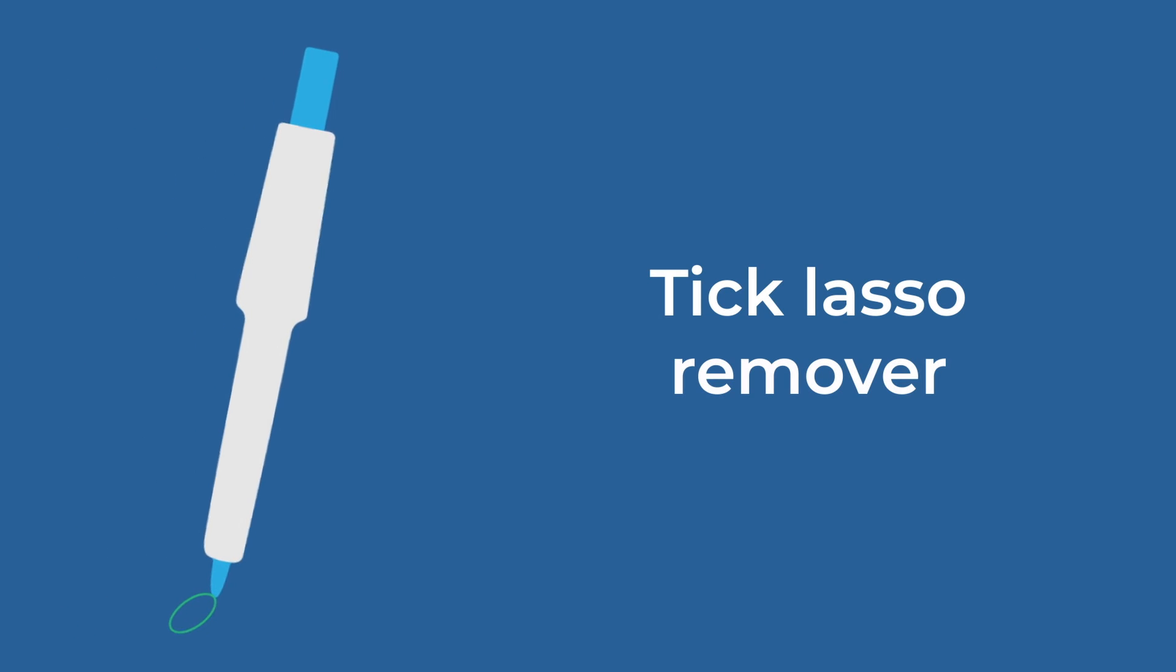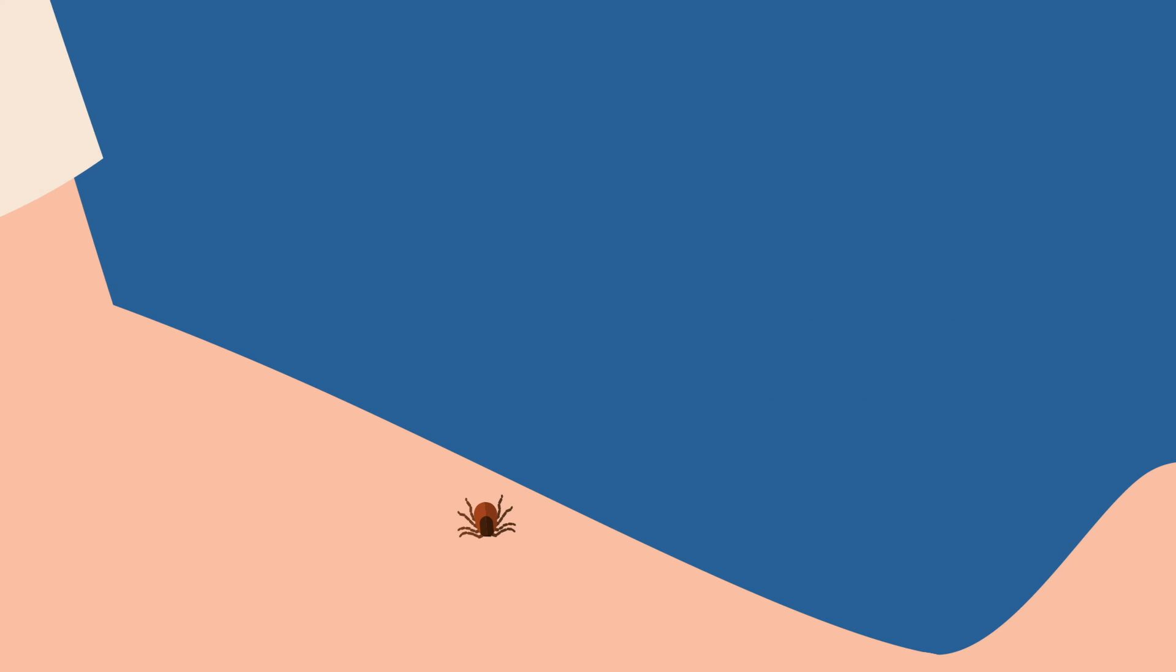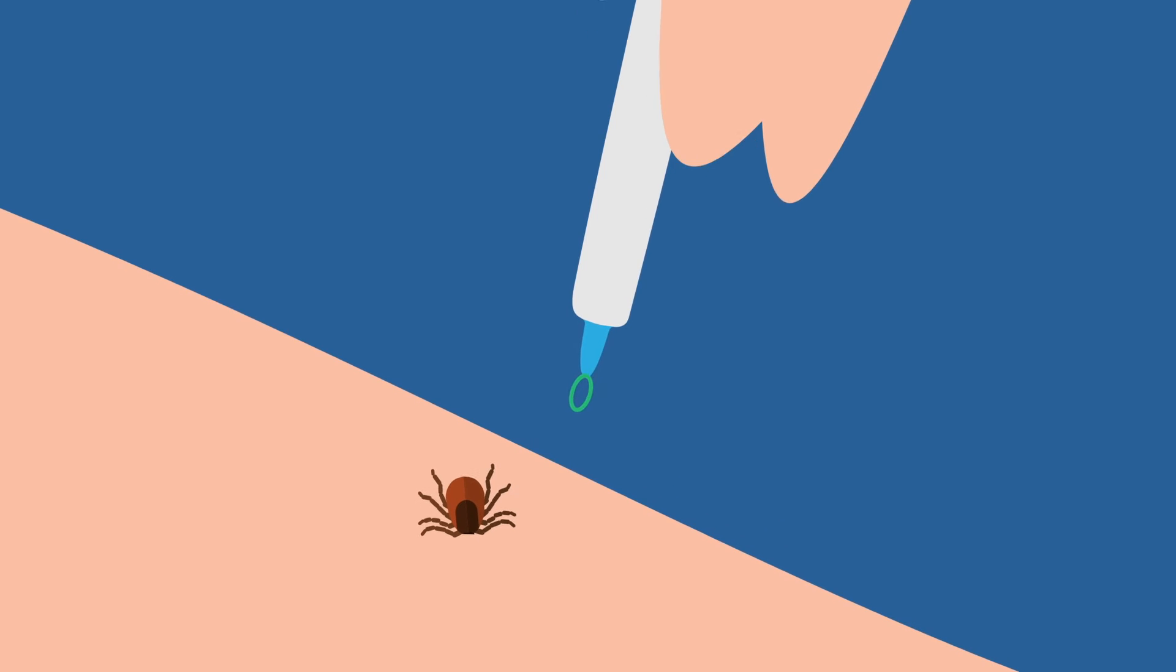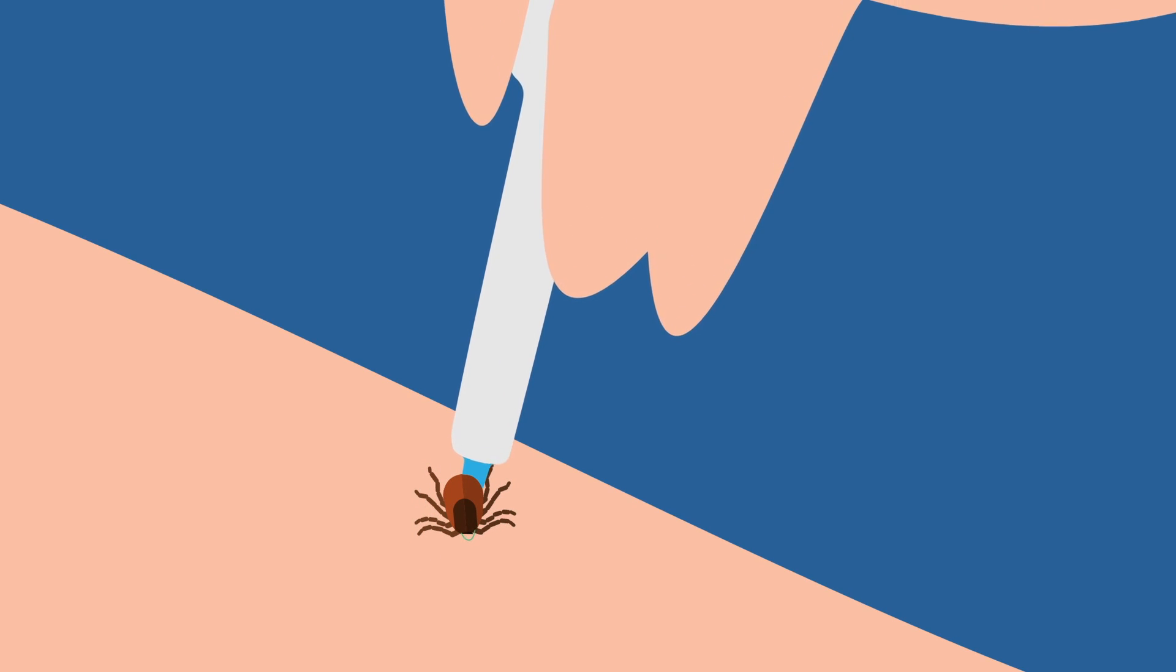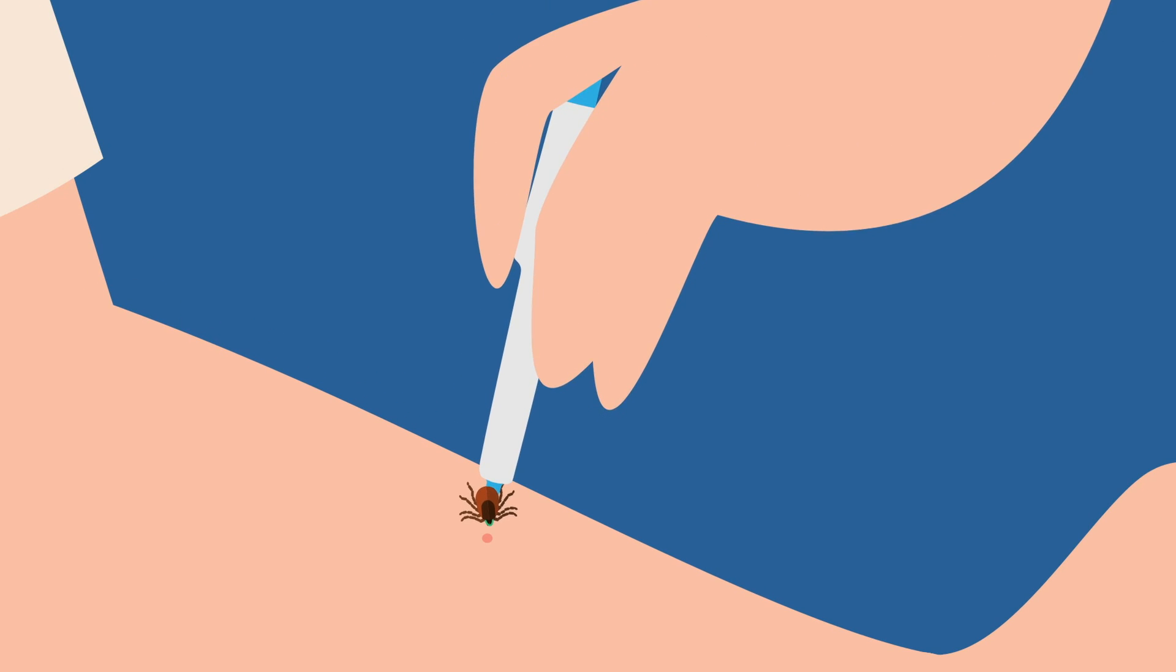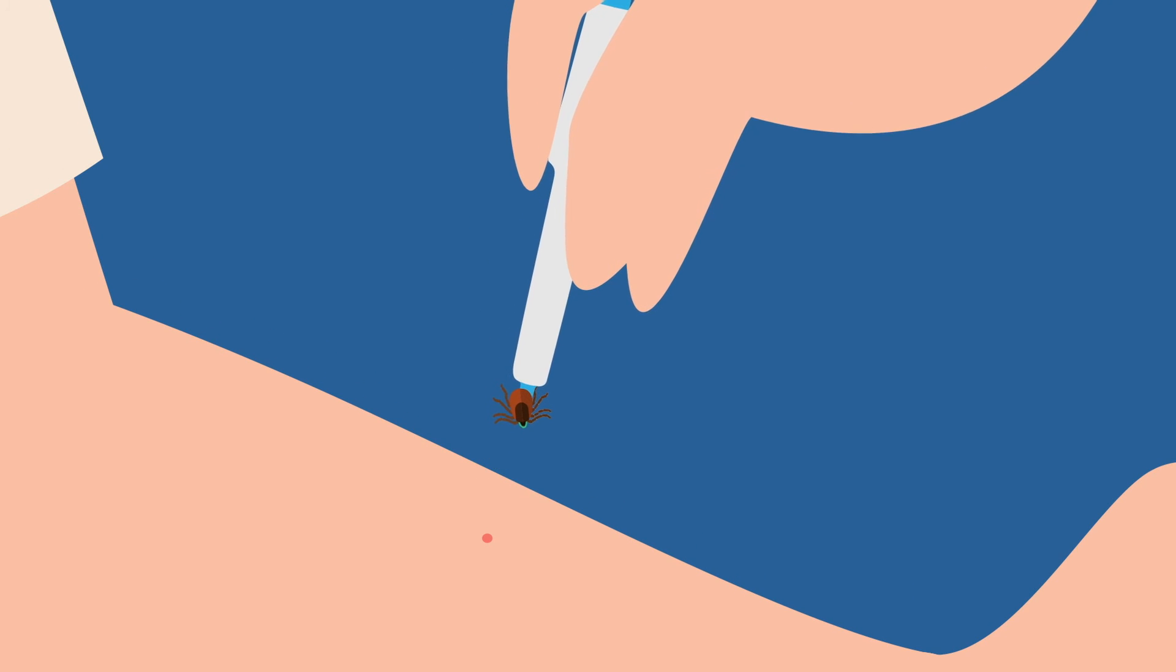Tick lasso remover. Slide out the loop and place it on the tick as close to the skin as possible. Release the button and, keeping the tip close to the skin, point the tool perpendicularly to the bite site. Make a rotational movement with your fingers using a loop in any direction while twisting the tick. Remember not to pull, but to twist the tick.